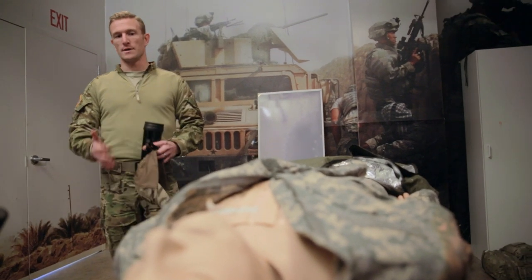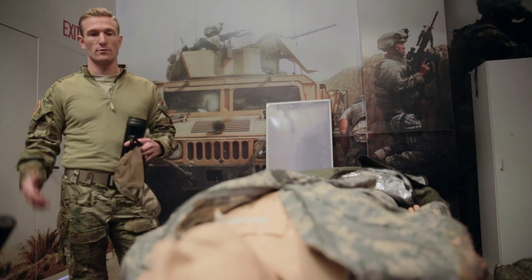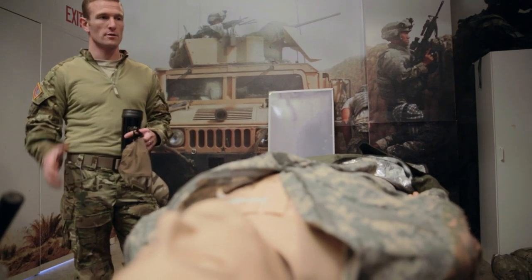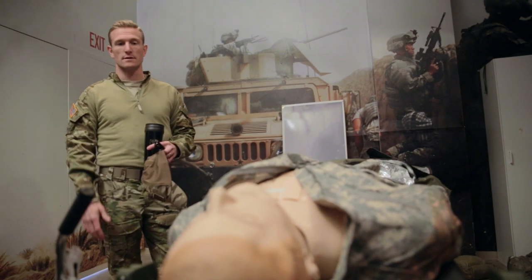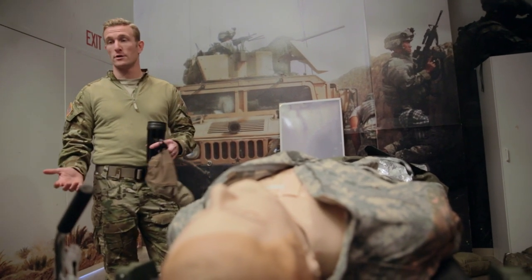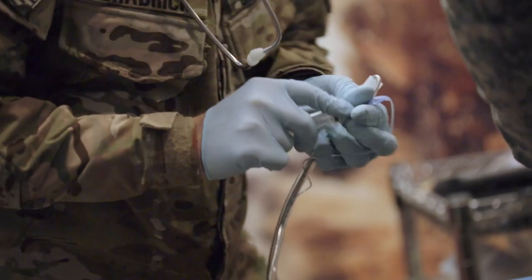At this point, this patient is simulating the same patient that we collected and brought to the helicopter. Now he's in a higher level of care. He should have most of the same injuries that he had before, and they're going to find some more injuries. For some of these guys, it's going to be the first time they see anything like this, because they're not medical guys at all.